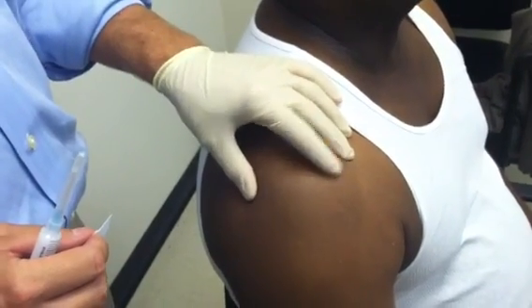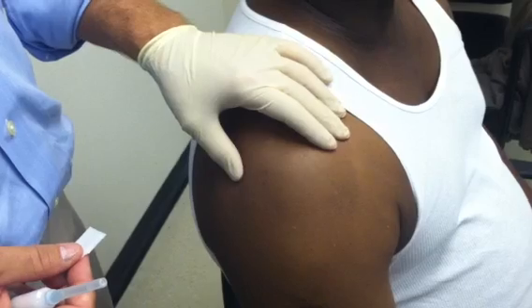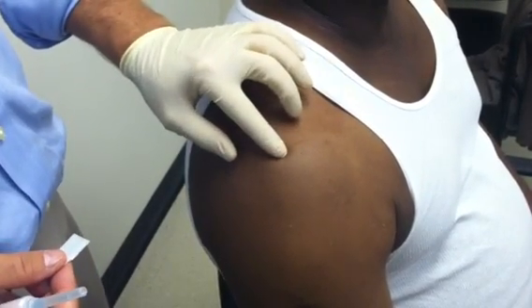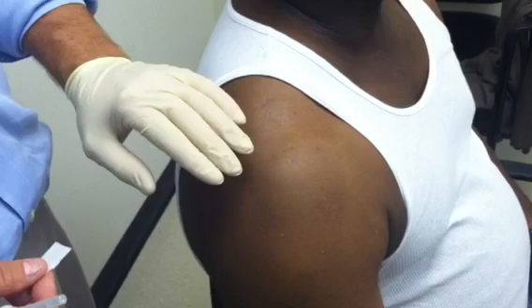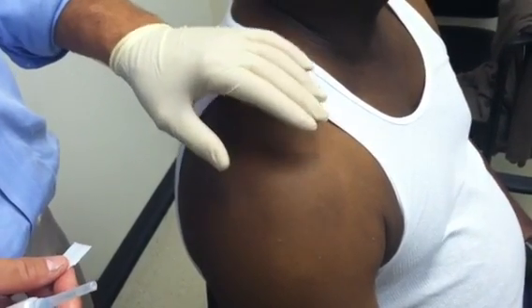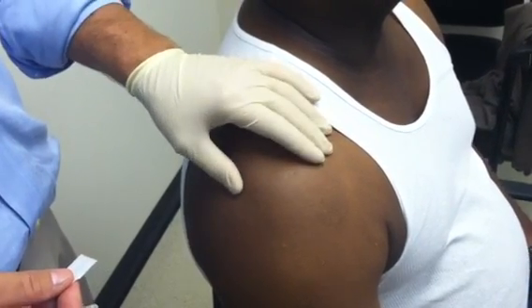We're going to do a subacromial injection for impingement syndrome. We do these to calm down inflammation in the shoulder. We put it below the bone in the shoulder called the acromion, but above the rotator cuff. We do it for two reasons: to help determine what the patient's problem is, and also to treat their problem, so it has a dual purpose.